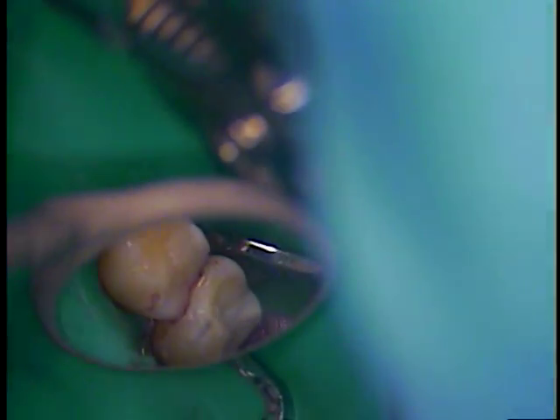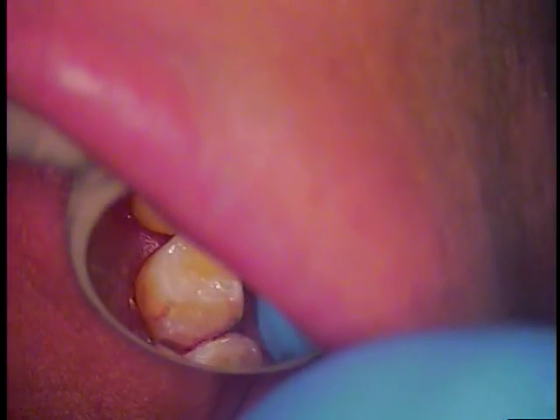Alright, let's get that off. Slide that back in just the way we started, over to distal. Okay, there we go - handoff, handoff, handoff. Can I have some articulating paper please?